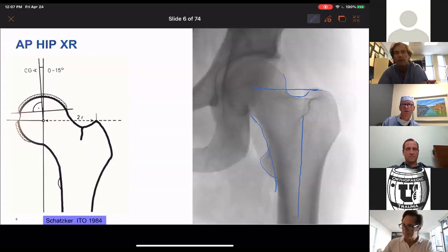Well, we're talking about pertrochanteric femur fractures. And so if you lose the greater trochanter and you lose the lesser trochanter, and all you're dealing with is the head neck segment and the shaft segment, you need to know what the AP of the head neck segment should look like and whether you're affecting it by rotating the shaft segment. So try to get that in your head. The shape of the inferior neck and the shape of the superior neck actually makes a difference.